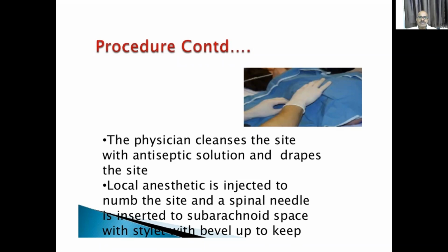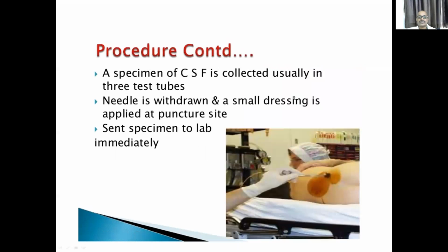Then a spinal needle is taken. After confirming that the local area is anesthetized, we introduce the lumbar puncture needle slowly into the L3 and L4 site. A specimen of the CSF is collected. While entering, suddenly a giveaway feeling is observed.